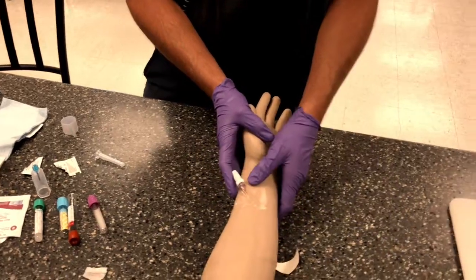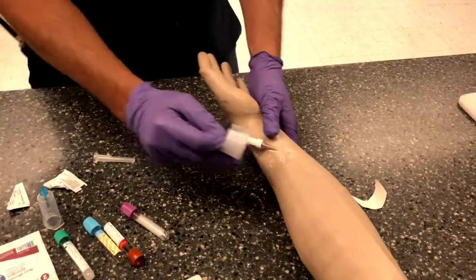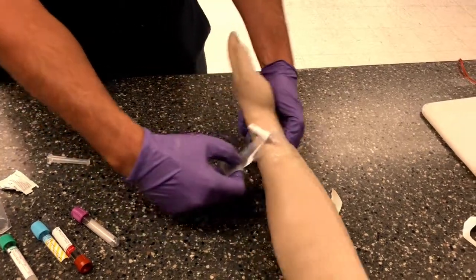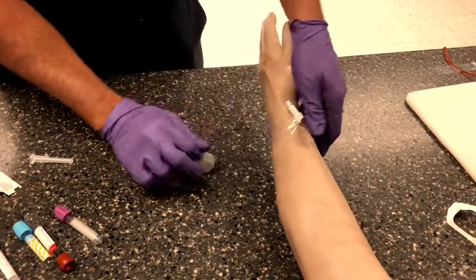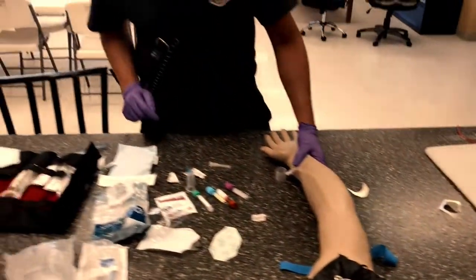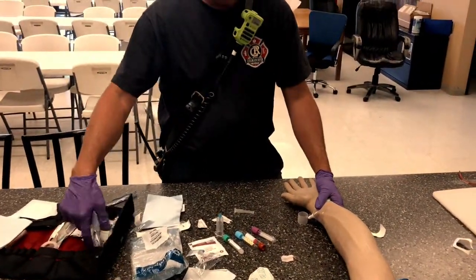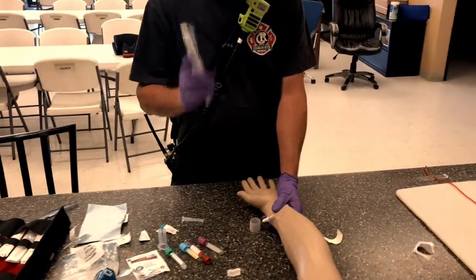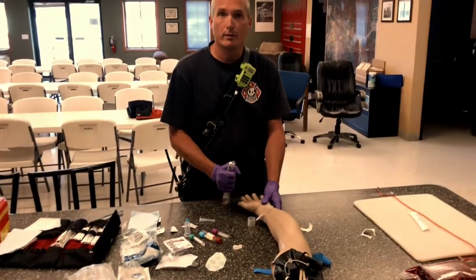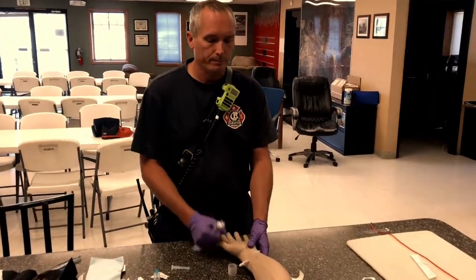And if we're adding a hub or an IV line, to use that tape in loop fashion, which we'll demonstrate again later. Once the IV is secure, we want to remove the tourniquet. And we want to make sure we got good flow, either with a flush or IV tubing, make sure we have good drops in our drop chamber.